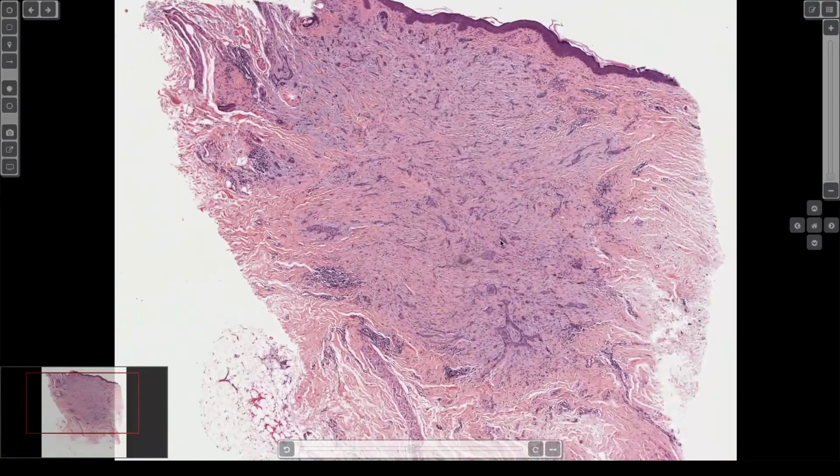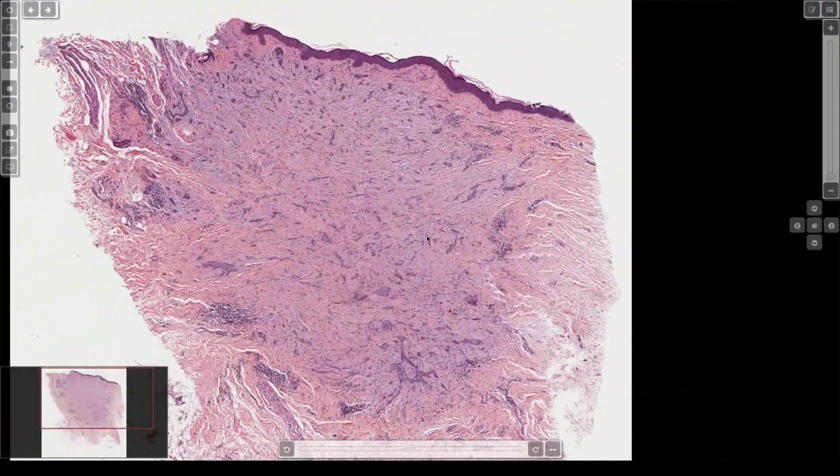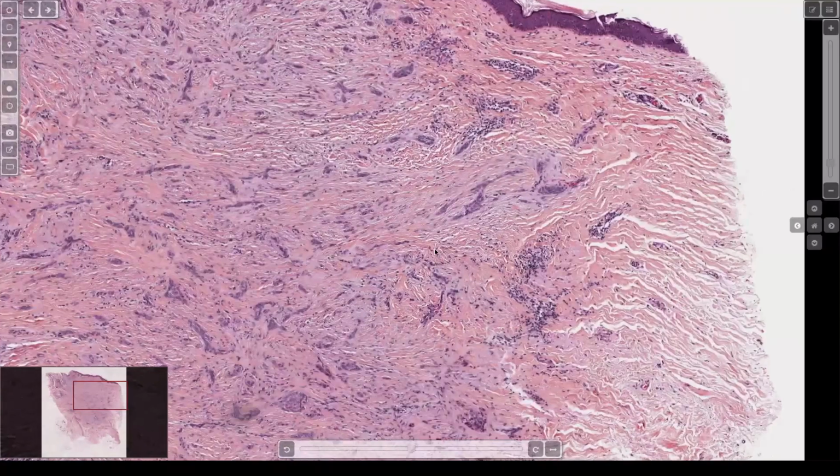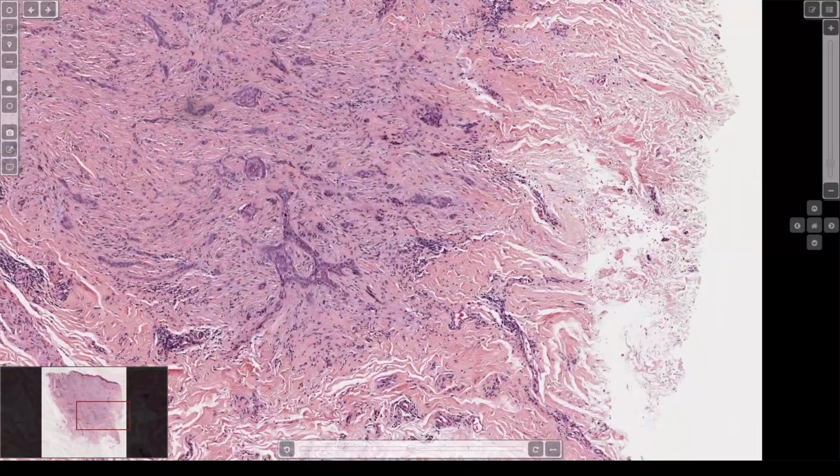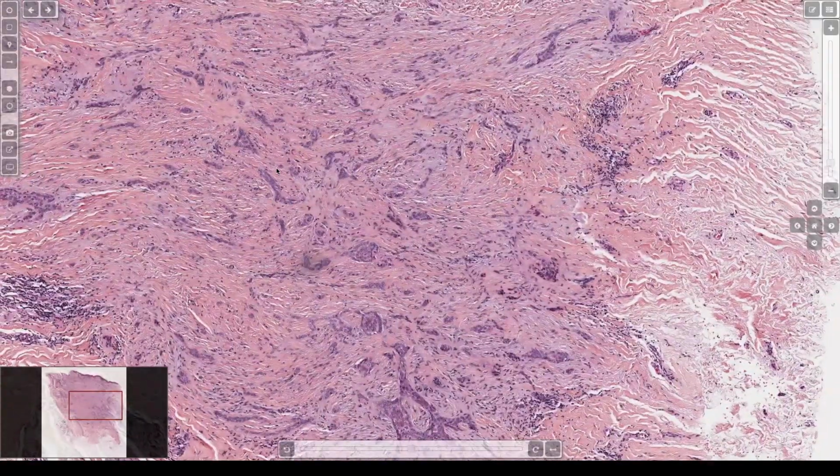All right, here we got an infiltrative thing. It's little basaloid islands, tadpoles in the dermis, right? So what would you do with this? Good. See, even on this one, which is actually pretty darn Morpheaform, there's still some islands that begin to look more like regular basal. You tend to get more of that myxoid change in the stroma.